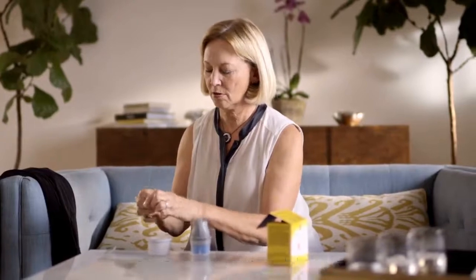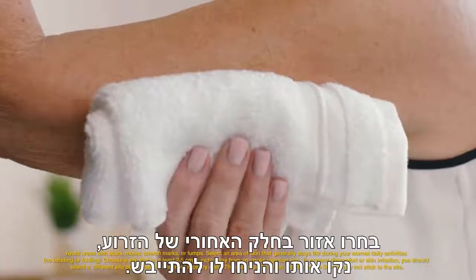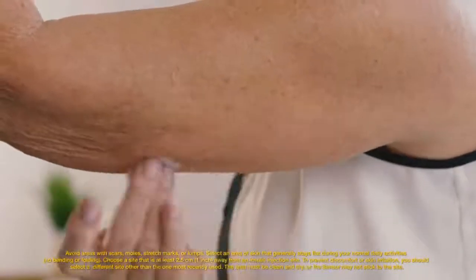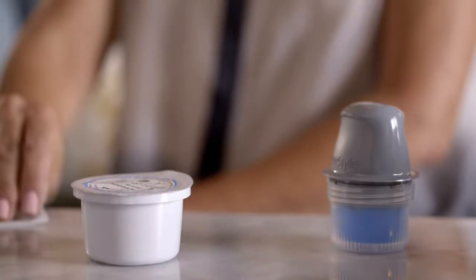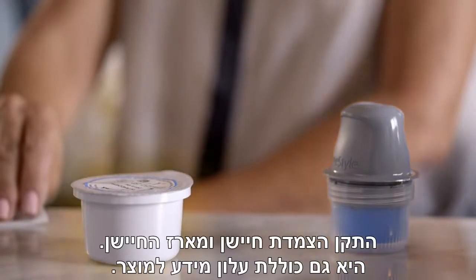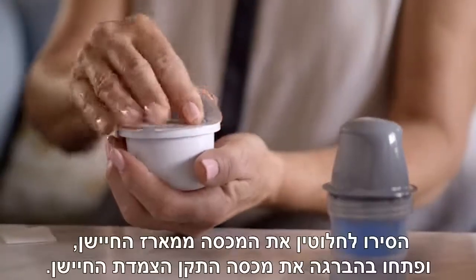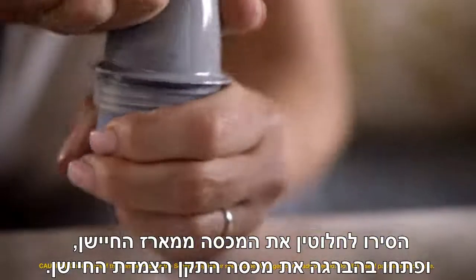It's easy to put on a new sensor. Here's how Sarah puts on the new sensor. Select the site on the back of your upper arm, clean it, and let it dry. The FreeStyle Libre sensor kit comes in two parts: the sensor applicator and the sensor pack. It also contains a product insert.